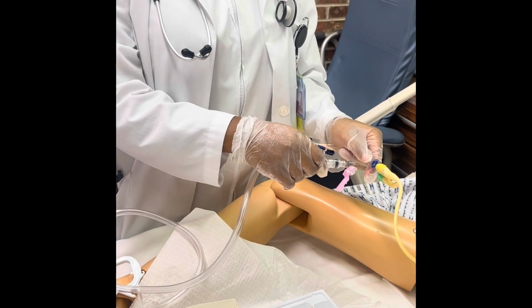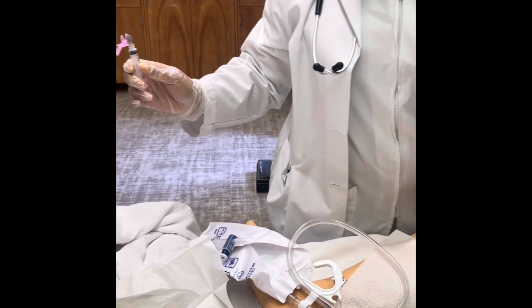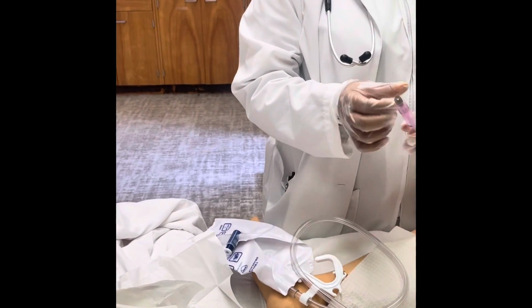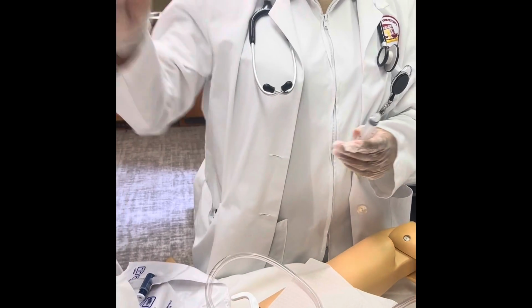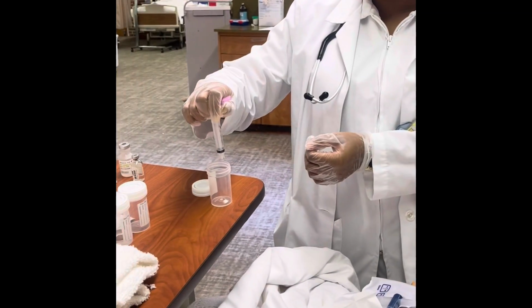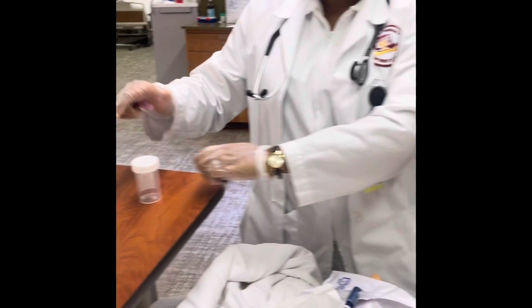Okay. Where does that go? The needle top. It's okay. I would throw this needle on there. Throw this in the trash, and then I can push the urine out into the cup. Initial and date it so it can go to the lab.